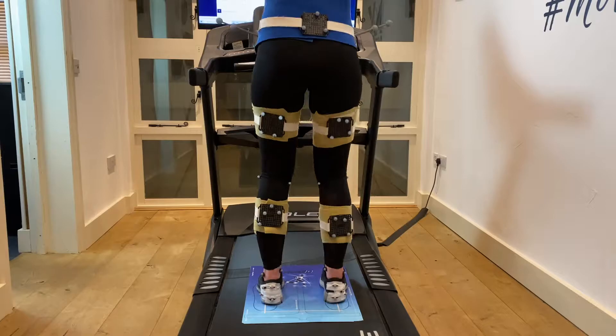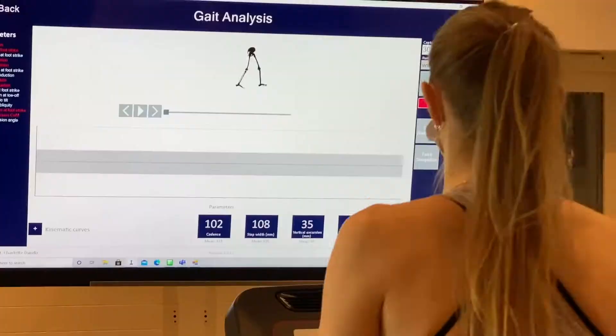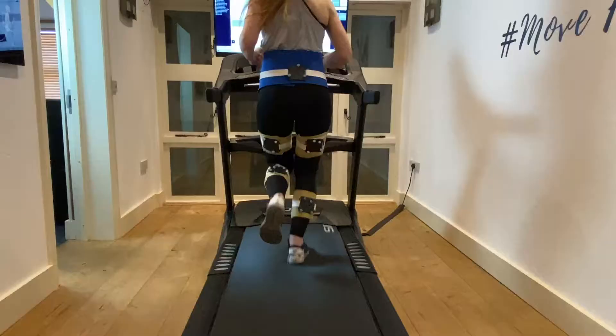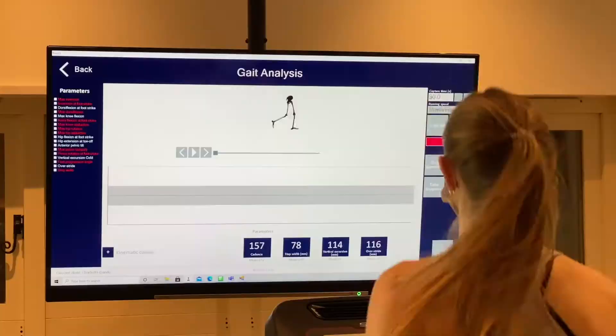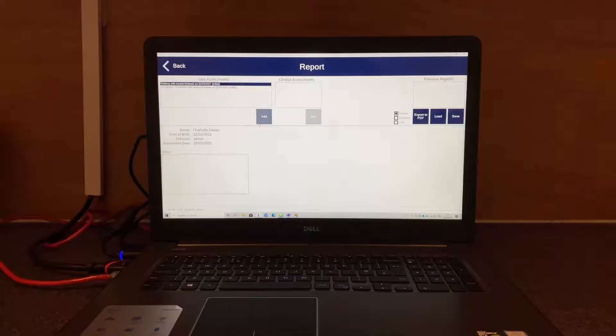There's an acclimatization period of around four minutes getting used to walking on the treadmill. After that we start collecting data, and here we can see in live format what is happening — the skeleton of the person walking on the treadmill. We can also capture running data at different speeds, with no orthoses, or in different shoes, to get an idea of what's happening.